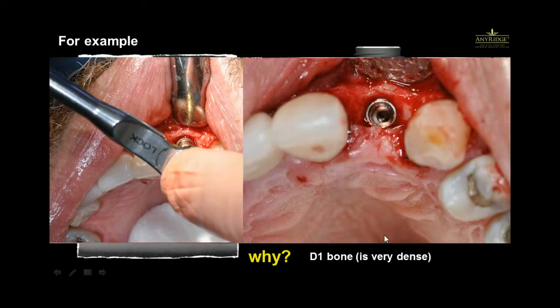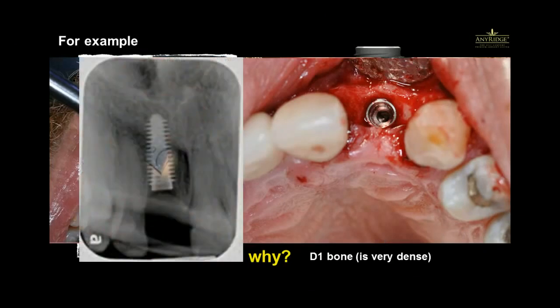Remember we talked about, after you place your implant and it goes into place, it's a little bit sticking up, then go ahead and grab your ratchet adapter and your ratchet and place your implant. Now this is not the final x-ray of this particular patient. However, this is illustrating the depth that you go, and it's 0.5 millimeter to 1 millimeter subcrestal. Okay? So please remember, very, very important, the fixture diameter is one, but the widest diameter of the actual thread is another. So only the top thread has that widest diameter.